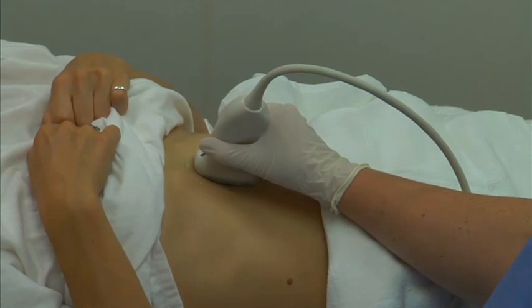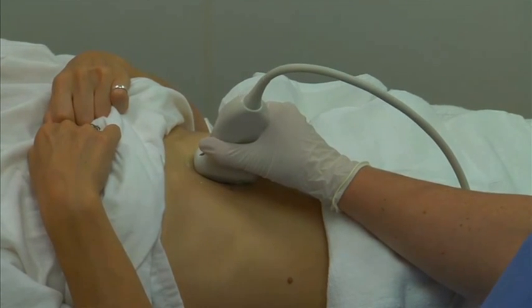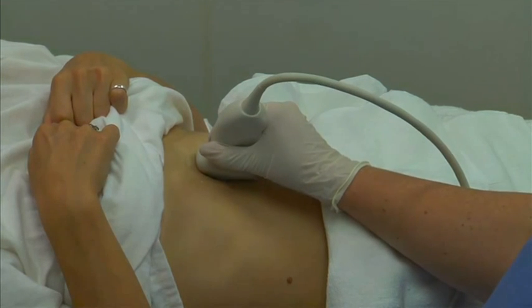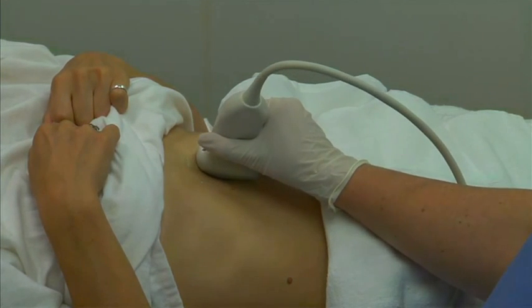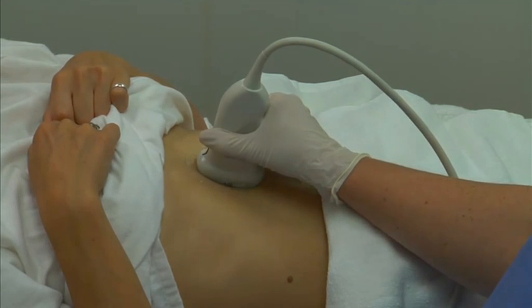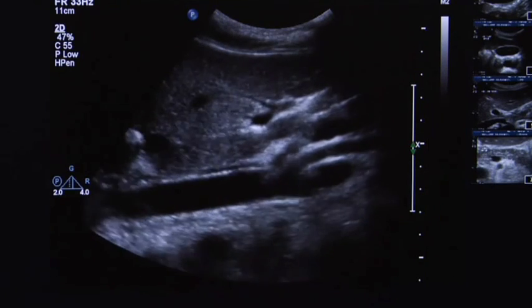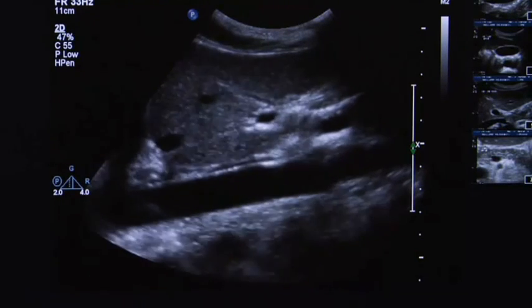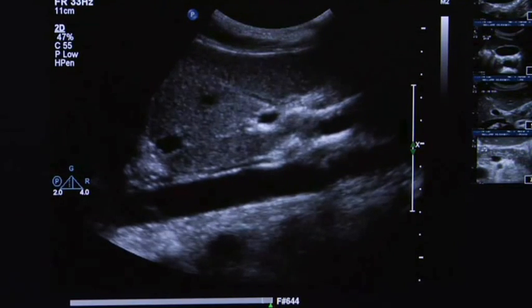Begin by scanning the proximal aorta. The most useful transducer placement for scanning the aorta is from the midline. The proximal aorta can be visualized just below the xiphoid process. Begin the scan in the sagittal plane and then sweep towards the patient's left to obtain a longitudinal image of the aorta.